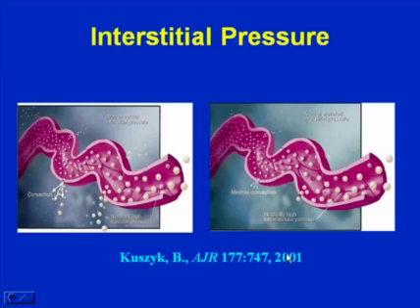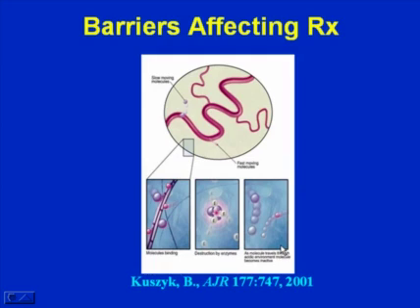And as you can see, whether or not the microbubble passes into the tissue or not is related significantly to the interstitial pressure. This has implications as to not only how we image them, but how the chemotherapeutic agents get into the tissue and fight the cancer.